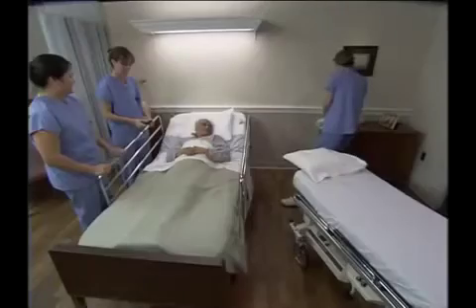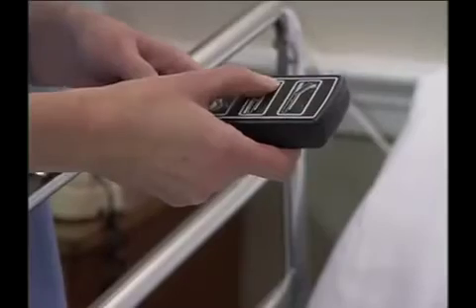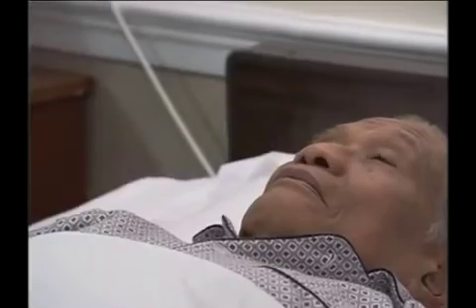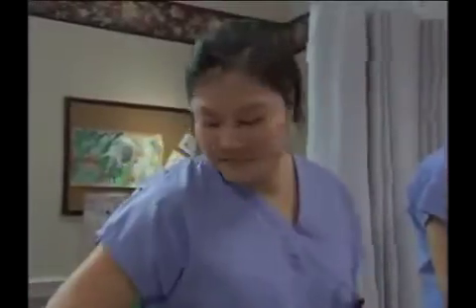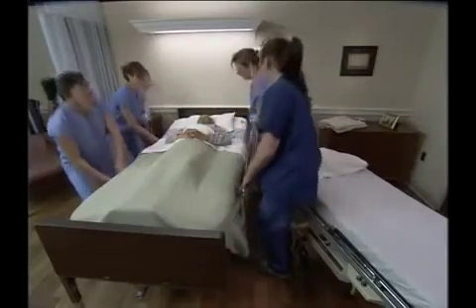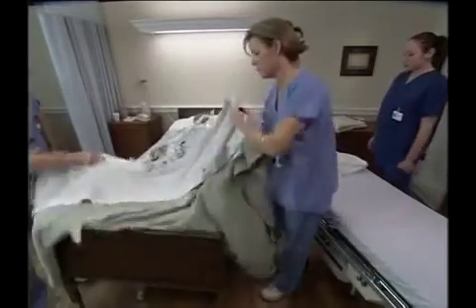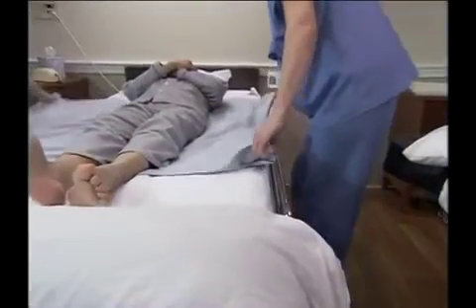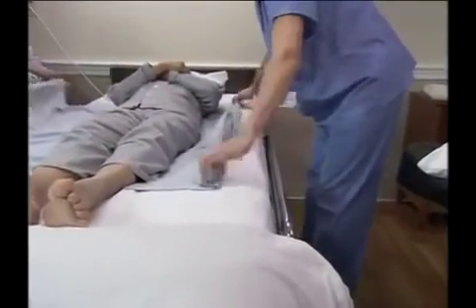on the person's bed. After identifying yourself and your co-workers to the person, and after explaining the procedure, raise the bed to its highest level. If there aren't any contraindications, lower the head of the bed so that the bed is flat. Make sure the bed's wheels are locked. Lower both side rails. Then, fan fold the top linens to the bottom of the bed. If necessary, untuck the lift sheet in preparation for transferring the person.